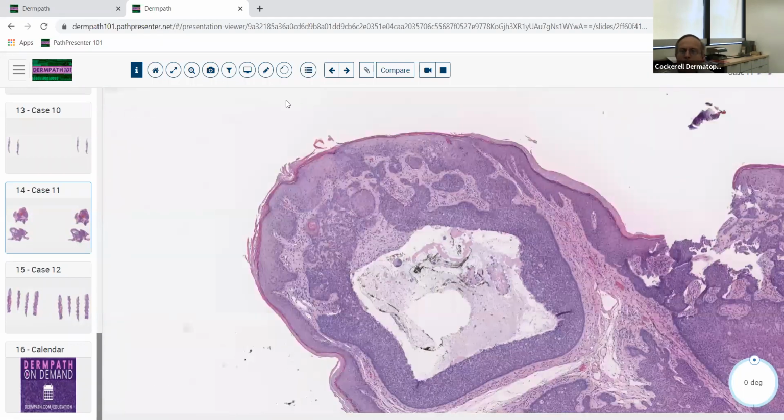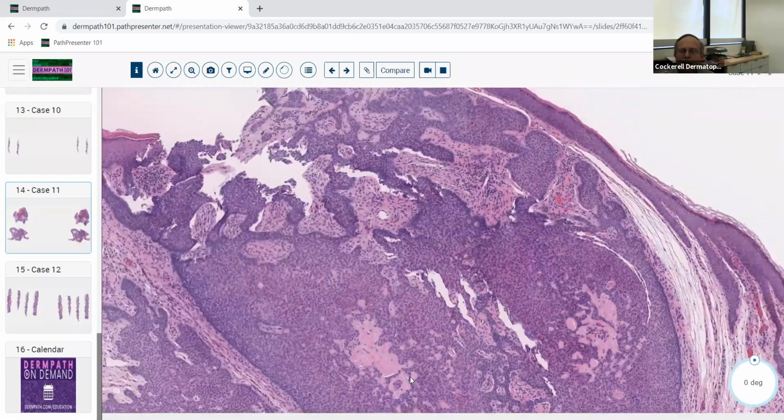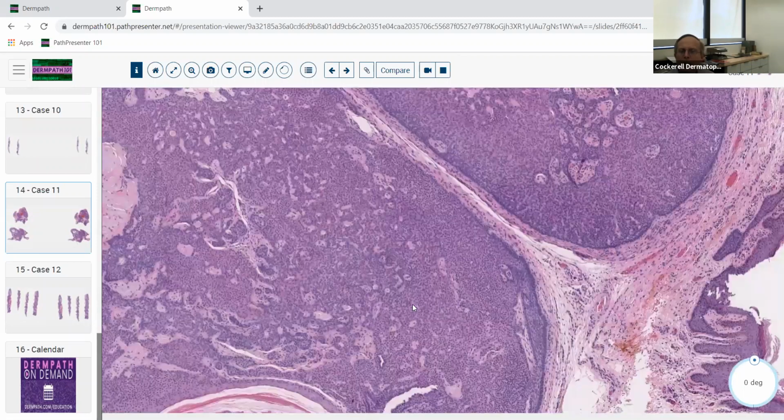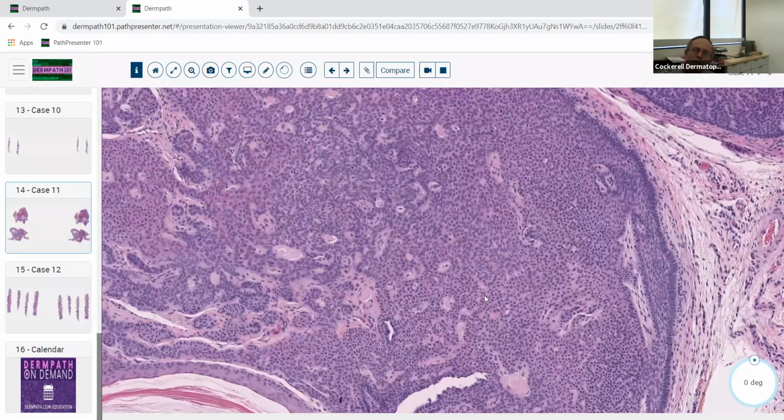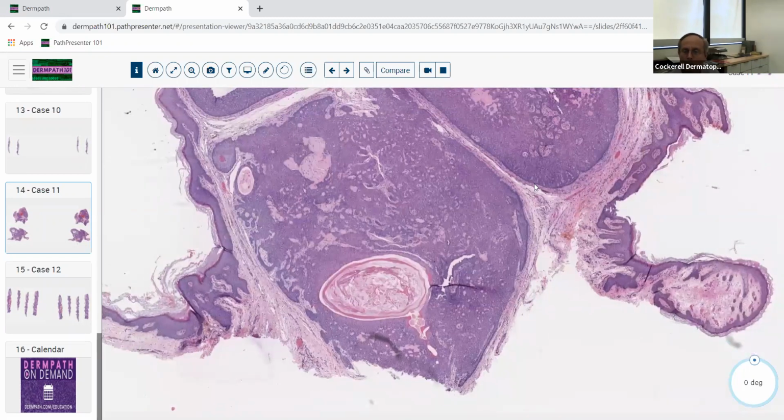And then we've got these other areas that look almost kind of like they're follicular in a way. And we see these lesions on occasion, often seen in a sun-protected area, where you've got areas that look like follicular differentiation in some zones, and then areas that look more like classic basal cell carcinoma in other zones. And we end up calling these lesions a lot of times a basal cell carcinoma with trichoblastic features. It's not really a true trichoblastoma, but it's in that general area. So basal cell carcinoma is an adnexal neoplasm with follicular differentiation, and it can give you a trichoblastic morphology sometimes.